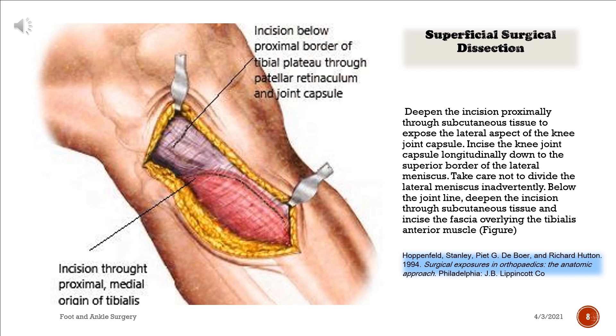Deepen the incision proximally through subcutaneous tissue to expose the lateral aspect of the knee joint capsule. Incise the knee joint capsule longitudinally down to the superior border of the lateral meniscus. Take care not to divide the lateral meniscus inadvertently. Below the joint line, deepen the incision through subcutaneous tissue and incise the fascia overlying the tibialis anterior muscle.